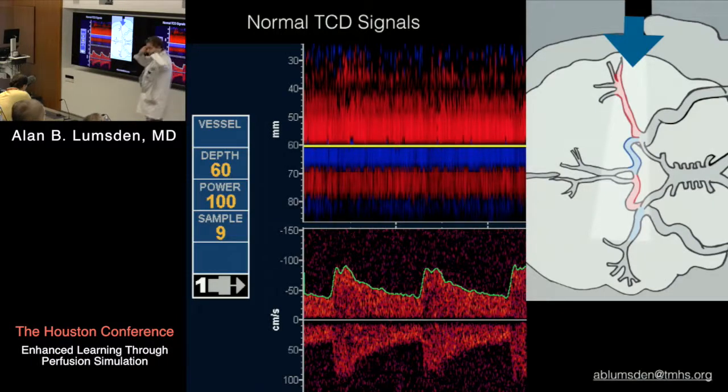So the TCDs are on both hemispheres, okay? We clamp the left carotid because we're going to do a bypass to it. And Zoll says, I'm now clamped on the carotid down here. He said, perfect. This reverses, becomes red. We're monitoring flow up here. It's dropped a little bit. You've got an intact circle of Willis. We're perfusing great, both hemispheres. That was the good part of this case. That was probably the only good part of the whole case, to be completely honest with you, because from that point on, it went to hell in a handbasket.